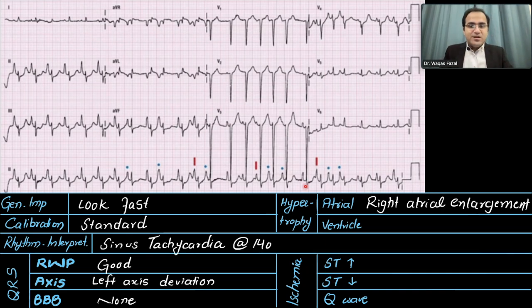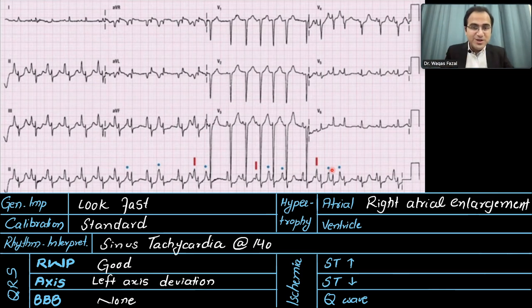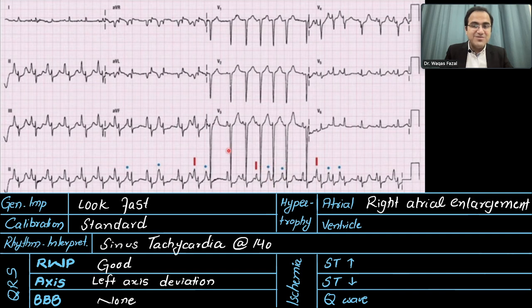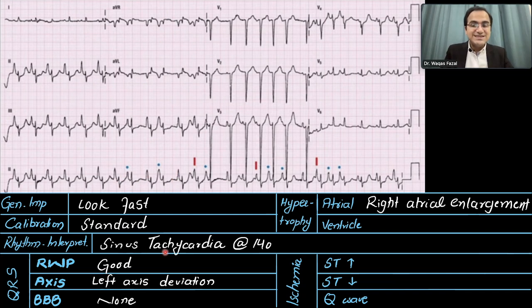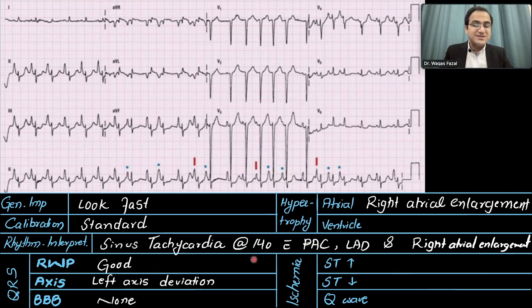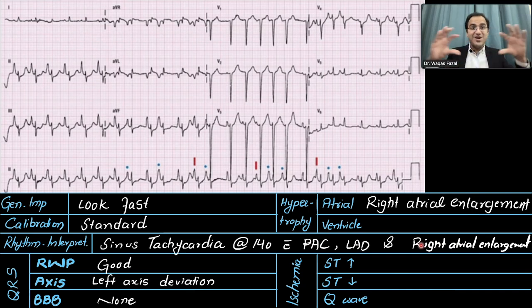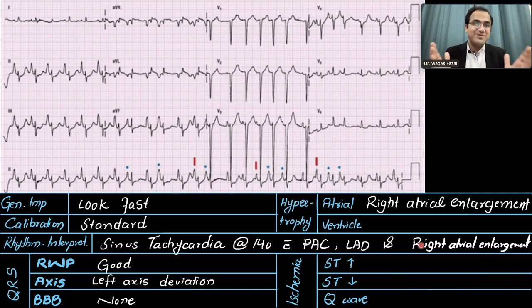For hypertrophy, looking at leads 2 and 3, there are tall peaked P waves. In V1, there is a huge positive deflection followed by a small negative deflection — a biphasic P wave. This is a classical presentation of right atrial enlargement. There are also premature atrial complexes marked by blue dots, which disturb the normal rhythm. So this ECG shows sinus tachycardia at 140 beats per minute with premature atrial complexes, left axis deviation, and right atrial enlargement.